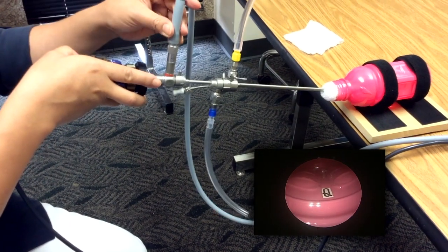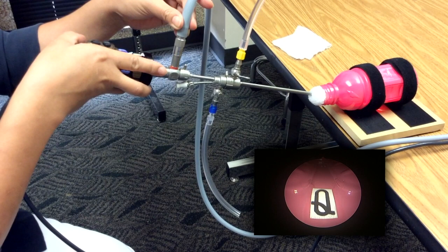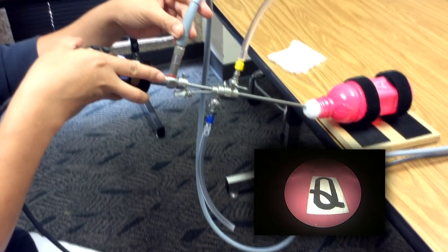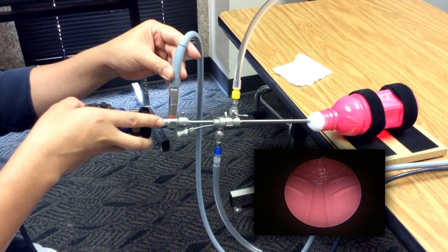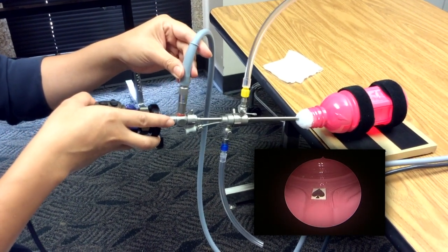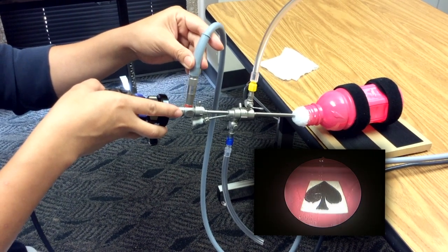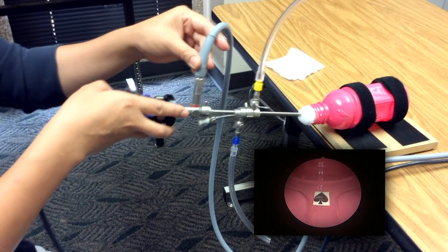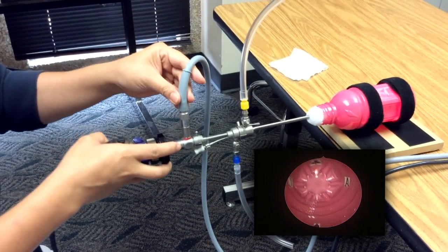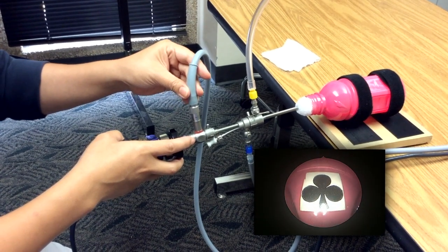With the light cord up, you'll be able to look down at the posterior wall of the cavity. The Q represents the posterior wall of the cavity at the level of the corpus. The spade represents the posterior wall at the fundus. The club is located straight ahead, symbolizing the fundus.